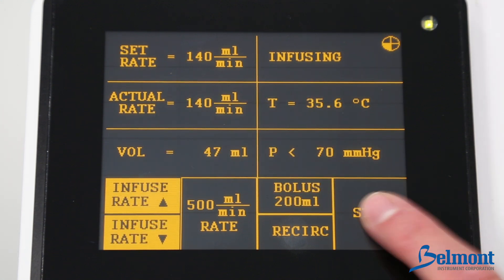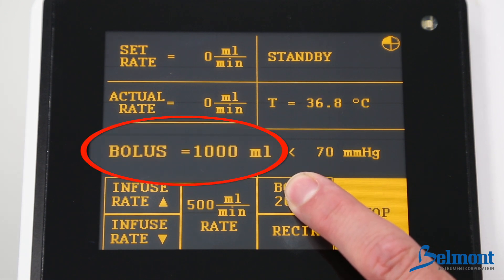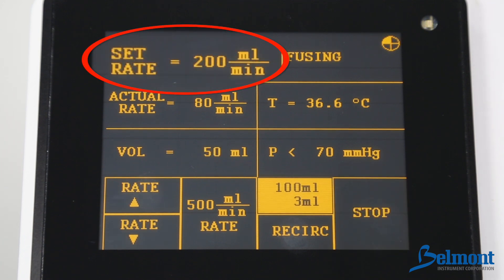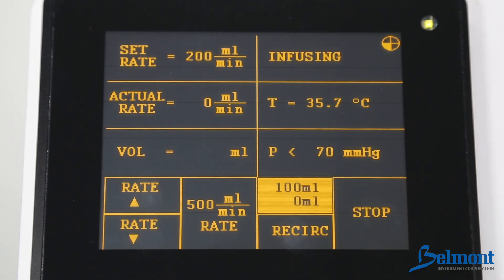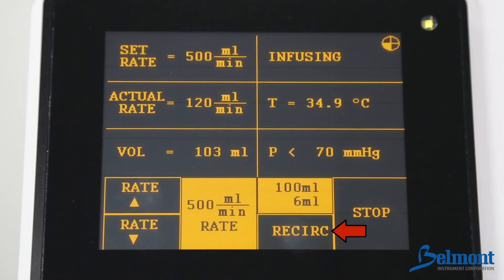To change the bolus settings, press stop and then press and hold the bolus key to scroll through the different values. When the desired bolus volume is displayed, simply release the bolus key. The default infusion rate is 200 milliliters per minute. To change the infusion rate, simply press the up arrow to increase the rate or the down arrow to decrease the rate. If you would like the bolus to be delivered at 500 milliliters per minute, press the bolus key and then press the 500 milliliters per minute rate key. Pressing the recirculation key will recirculate fluid through the reservoir and disposable circuit. This feature is used to warm and mix fluids and will automatically stop after five minutes.